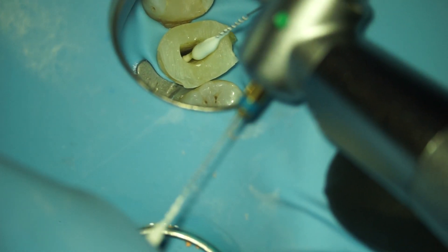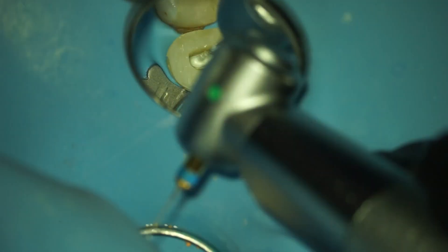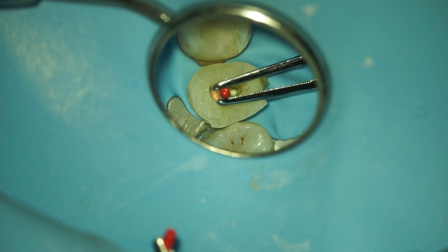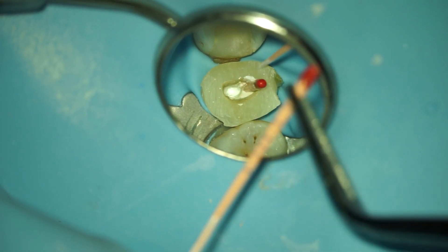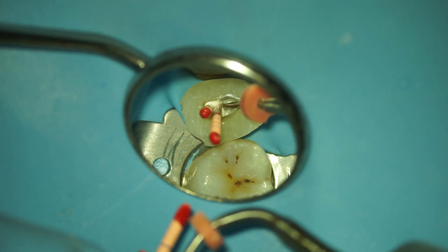After the canal is dried, I apply some sealer using a lentulo. I use bioceramic sealer — in this case Ceraseal from Meta. Then I put in the gutta percha. Because we have an oval canal, I use two cones to get the sealer everywhere. When you use bioceramic sealer, you should think of the sealer as the filling material, not the gutta percha. Obviously I remove the excess gutta percha and use my plugger to make sure it adapts well.